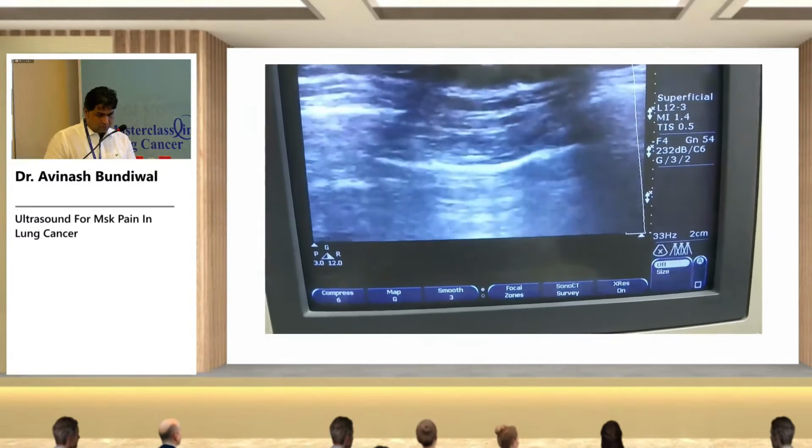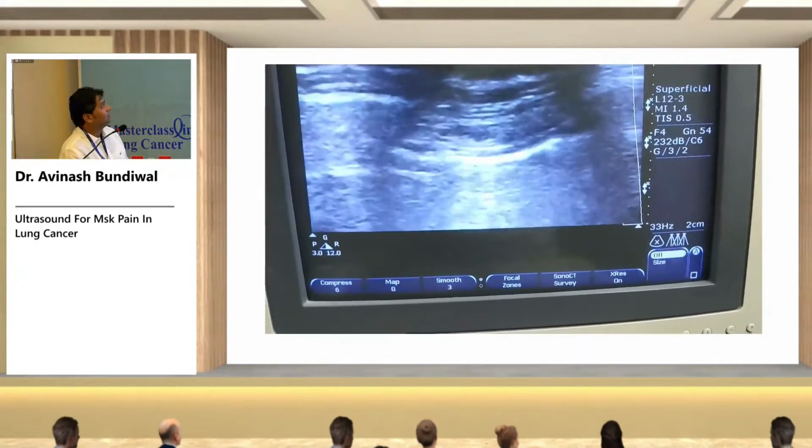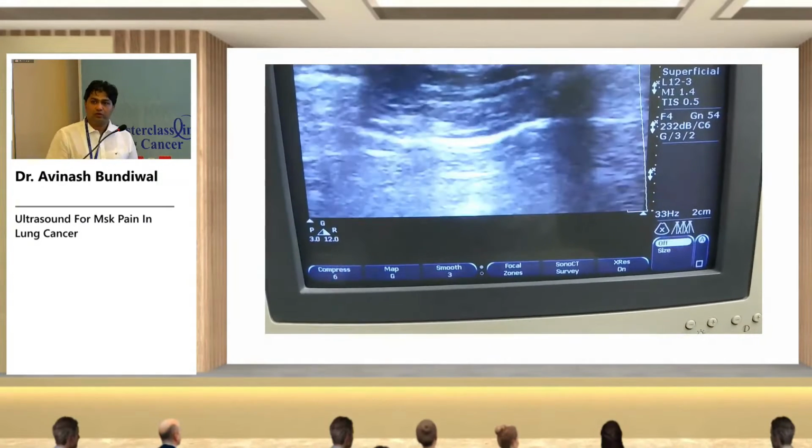गहरी सांस लो. So in this you can see this is shimmering appearance of the pleura. Here is the cephalad, here is the caudal, and this is the rib. So उसको गहरी सांस लेने का क्यों बोल रहे हैं? ताकि हम प्लूरा को फेशियल प्लेन के साथ डिफरेंशिएट कर पाए और हम देख पाए कि ये प्लूरा है.